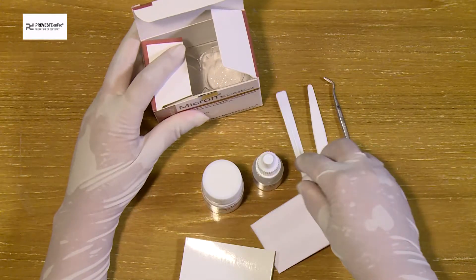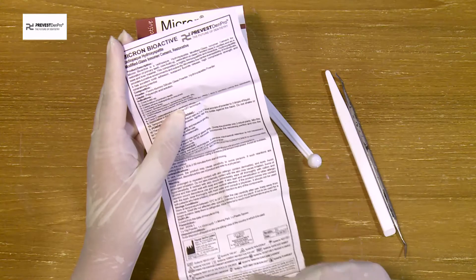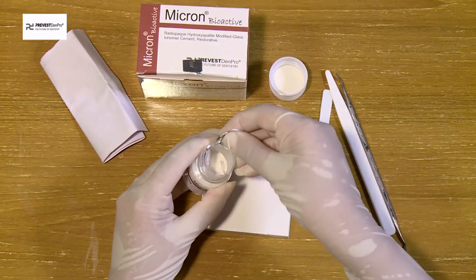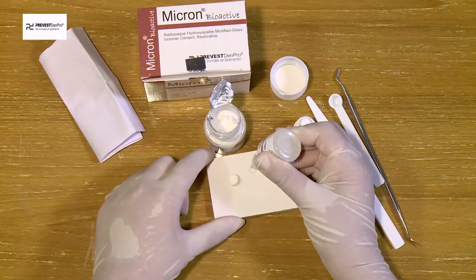For manipulation, take one scoop of powder and one drop of liquid.